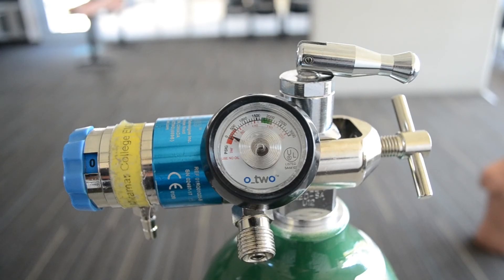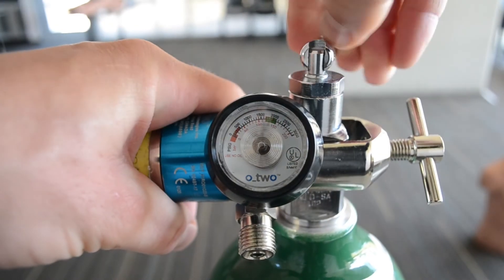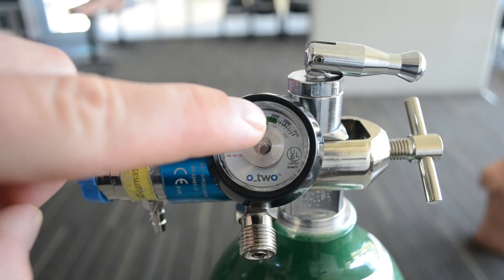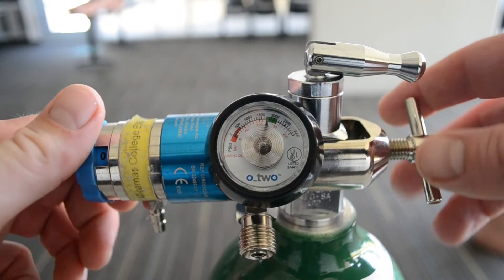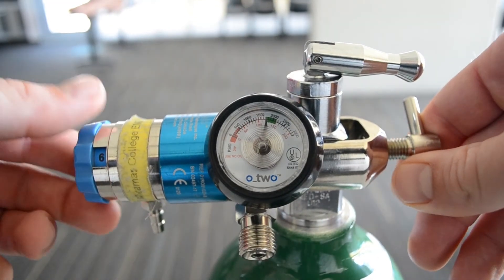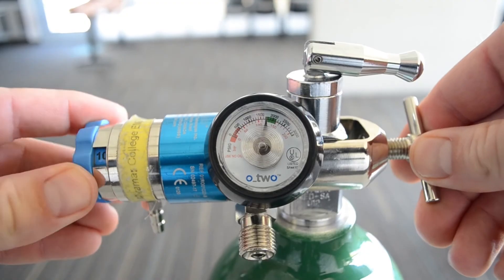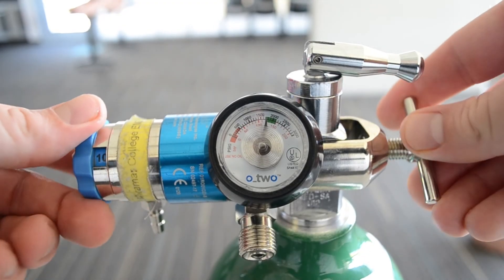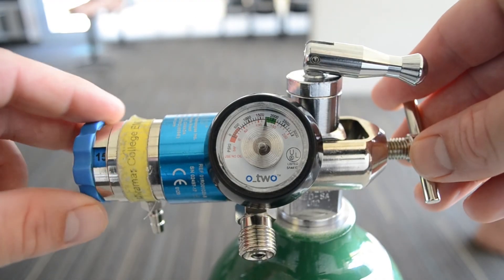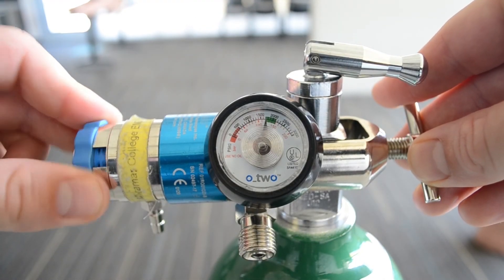So once we've got the regulator on our bottle, we'll go ahead and pressurize the regulator. We'll do that simply by turning this one full turn. You can see the dial has jumped up. And now you are able to adjust the flow rate as needed. So this would be 6, the high end of a nasal cannula. This would be 10, the low end of a non-rebreather. And this would be 15, either the high end for a non-rebreather or your go-to for using a bag valve mask.